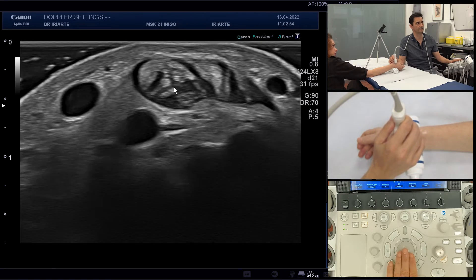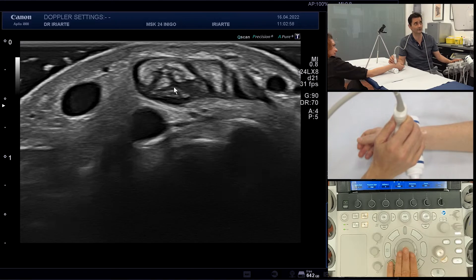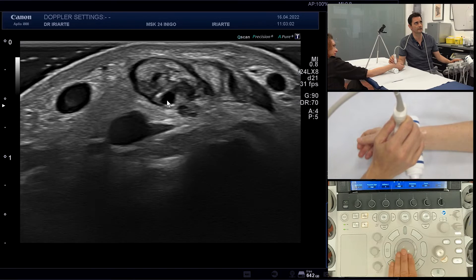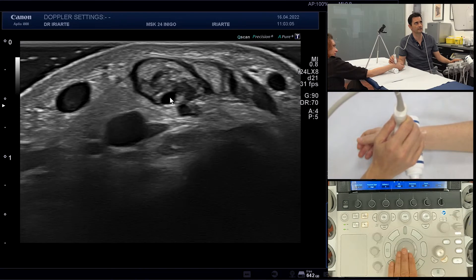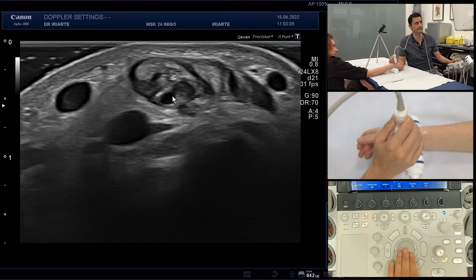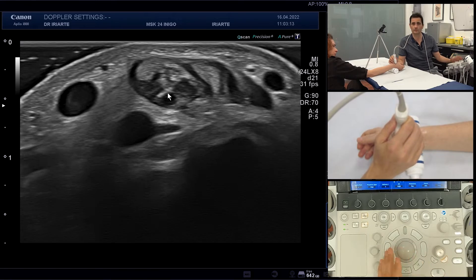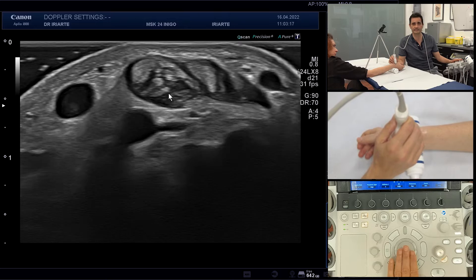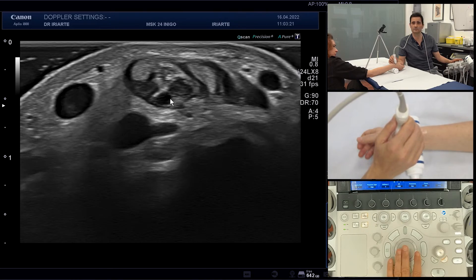You can see the thickness of the compartment and as we go distally you can see how this tendon becomes thicker, with heterogeneous echogenicity and areas of anechoic images, telling us there are some tears inside the tendon. Now I wanted to know how active the synovitis is, so we must use Doppler.